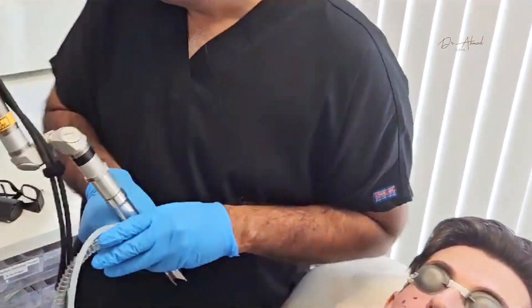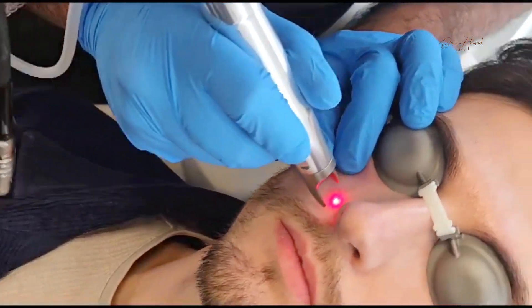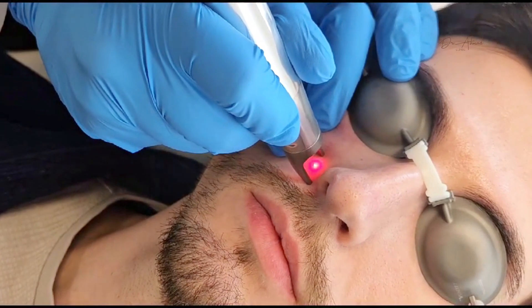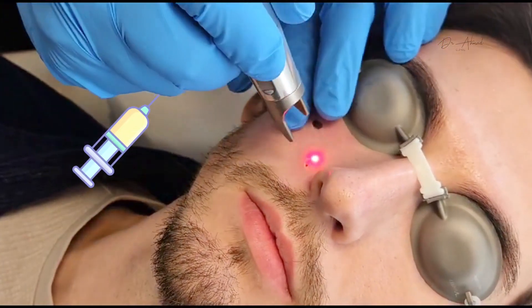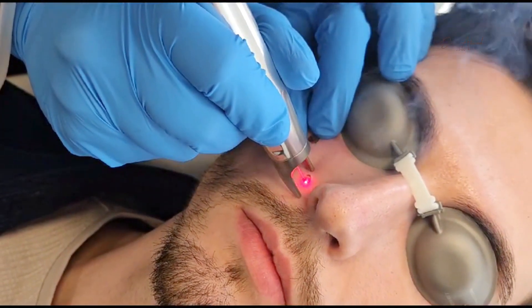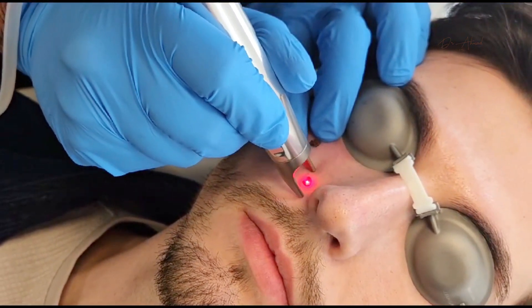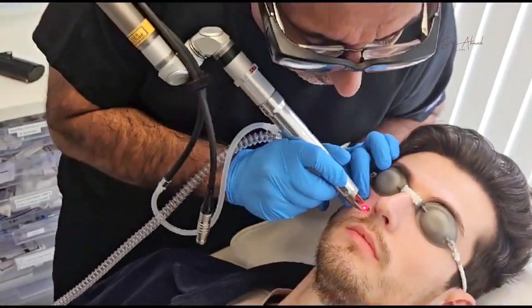And now we have this area here. It's quite simple — you place the laser on there. We've already injected with local anaesthetic so the patient doesn't have to feel any pain. And it's as simple as that, and that's the whole area gone.